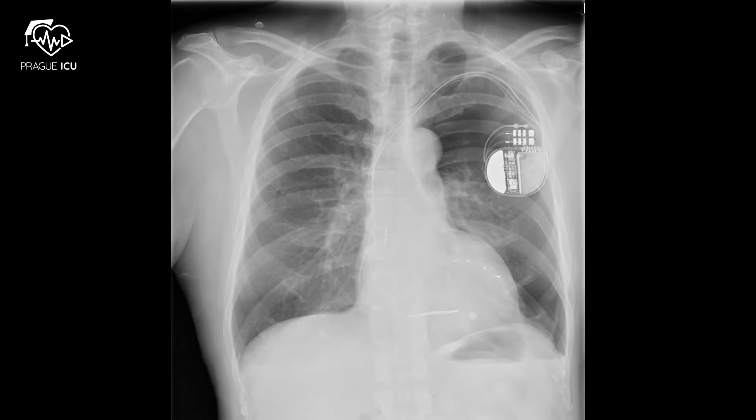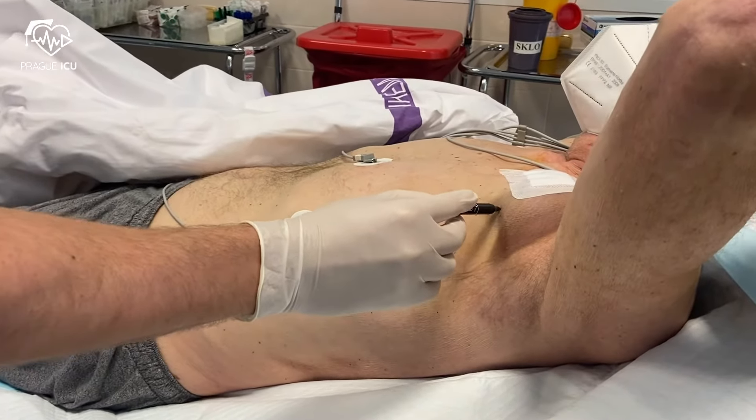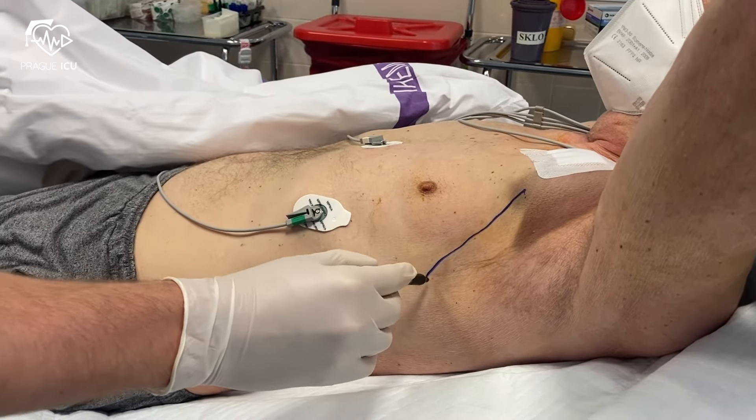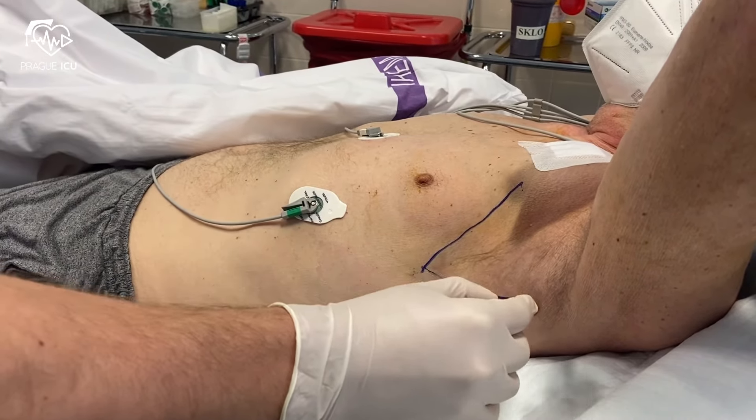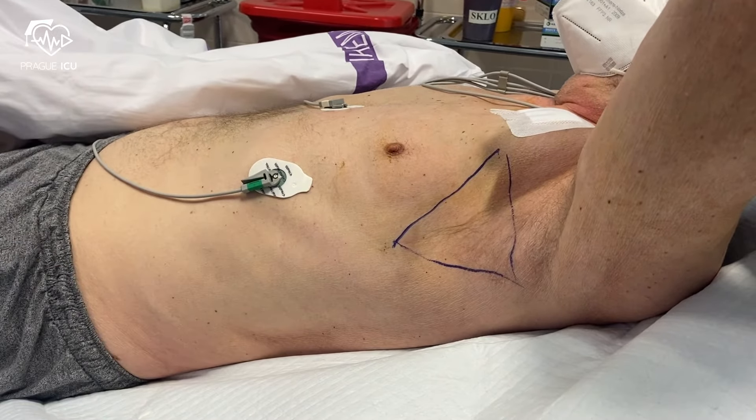Our patient was reported to have a large iatrogenic pneumothorax on x-ray as a complication of a CRT insertion. With the arm abducted, the apex of the area of interest is the axilla. The triangle of safety is formed by the lateral border of pectoralis major anteriorly, the lateral border of the latissimus dorsi posteriorly, and inferiorly by a horizontal line from the nipple, commonly the 5th intercostal space. Be cautious as the nipple line may be an unreliable landmark in female patients due to breast tissue.